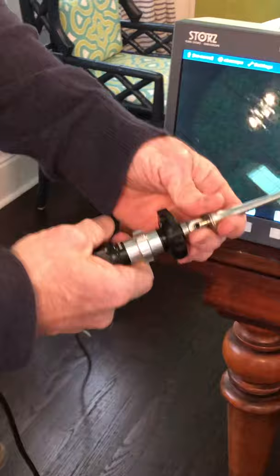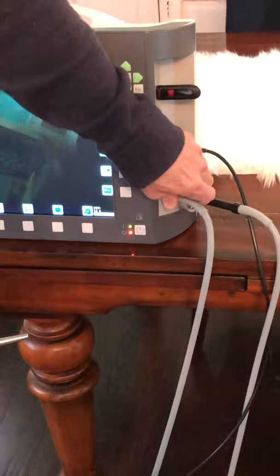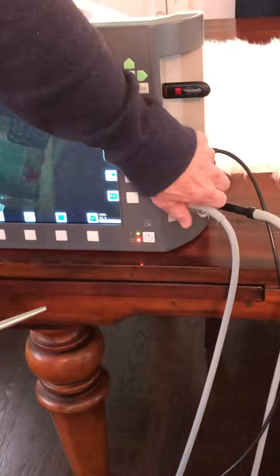Now you can take your light cable and that screws right onto the post on the scope.